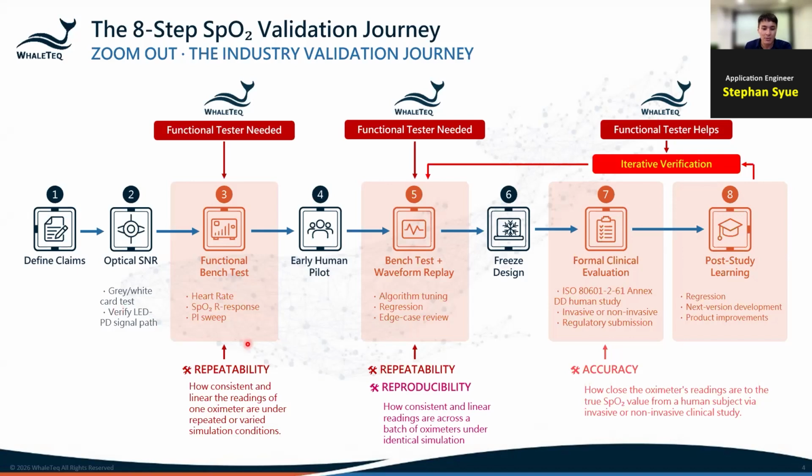And then number 3 is where we use the SpO₂ signal simulator for bench testing. So we start verifying hardware response, SpO₂ behavior, and repeatability under various conditions. You can control PI, heart rate, and waveform morphology. You can build a real engineering data set. I'll go deep on this in just a few minutes.